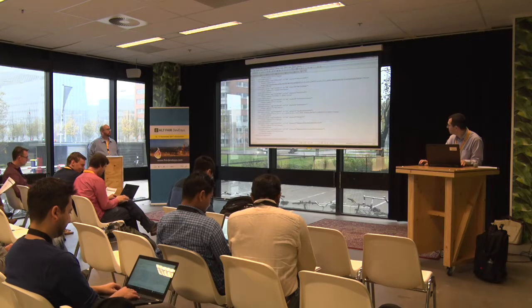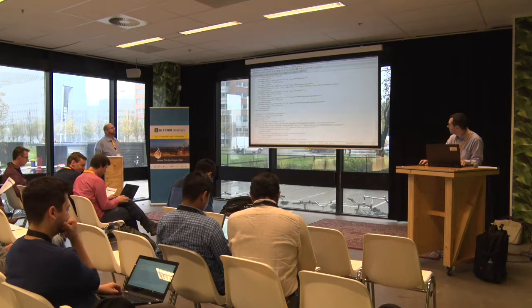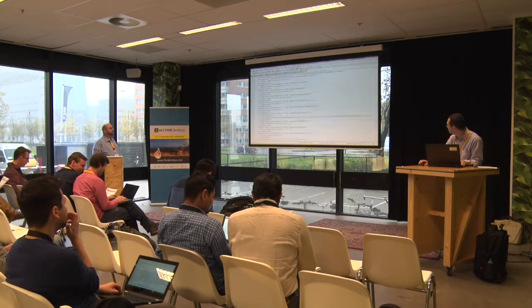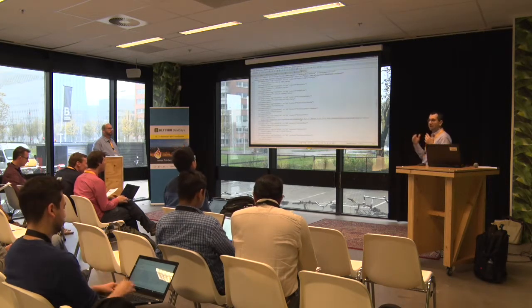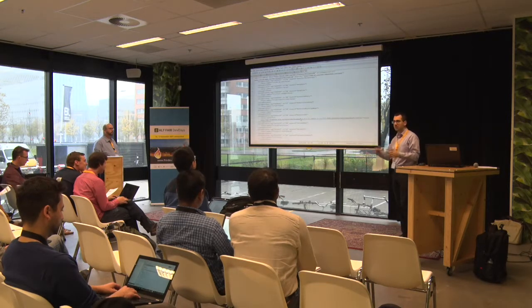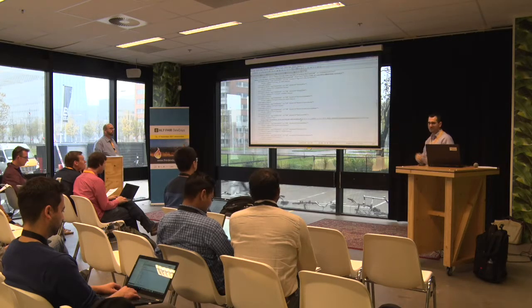But what it is saying here is that it's actually returning, if you notice there are 4 parts in this response, I believe, or actually maybe 2, I can't remember exactly. But each part of this response is a study. So in this case, I'm saying, tell me what you have for this patient, Joe Sim. It's coming back saying, here's one study, another study, et cetera, et cetera. Each part is a study.